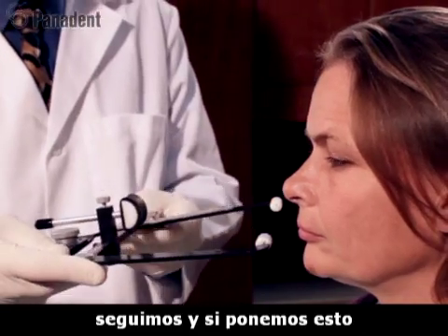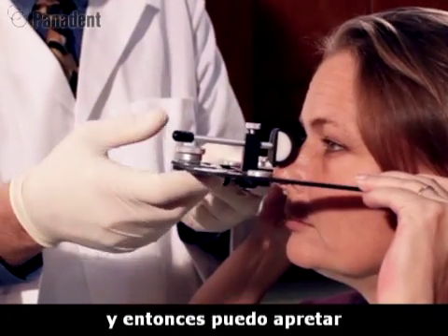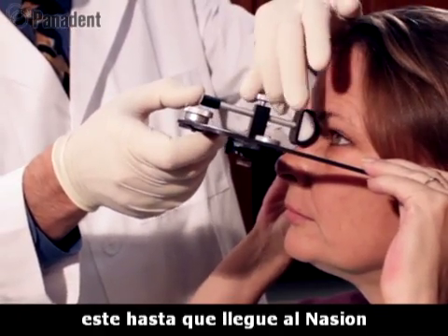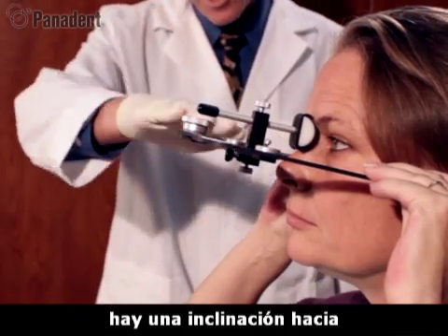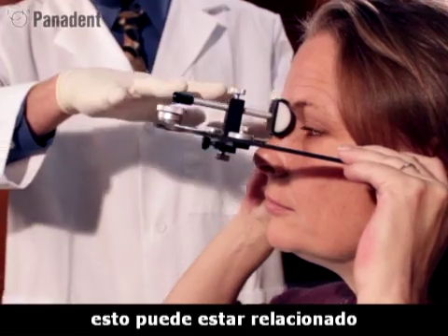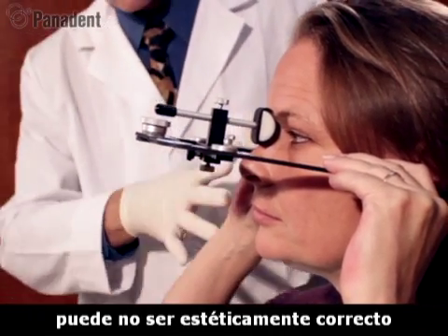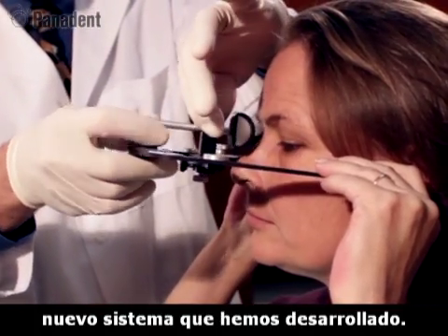If we put this onto a patient and go ahead and reach up and put this in your ears like a stethoscope, I can tighten a large screw here and raise or lower this until I get to the nasion relator. When the patient is sitting erect looking forward, you can see there's a cant upward to the face bow. Although this may be related functionally correct to a plane of reference in the axis, it may not be aesthetically correct when we get to the articulator. So we're going to show you a new system we developed.